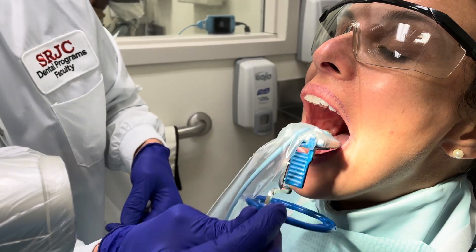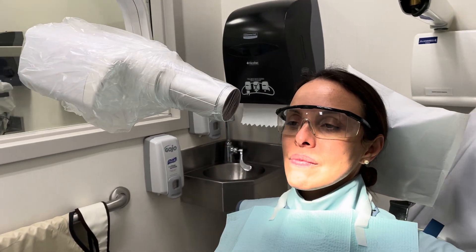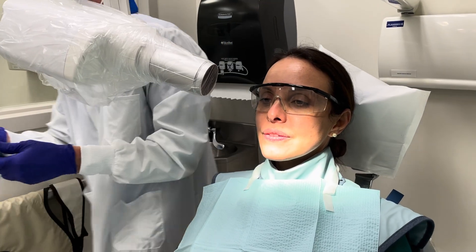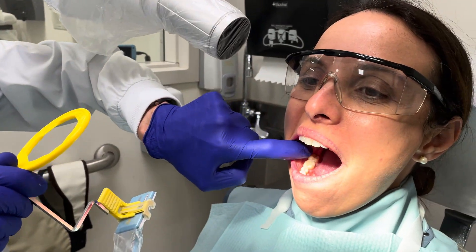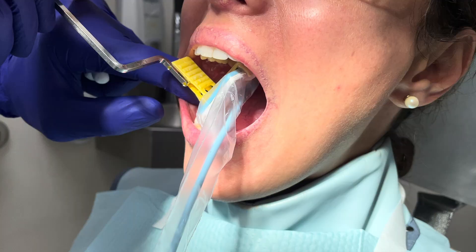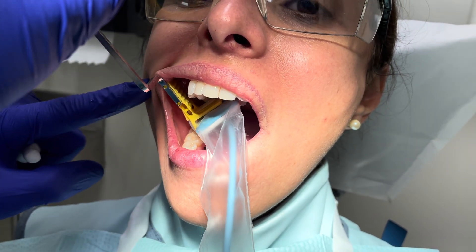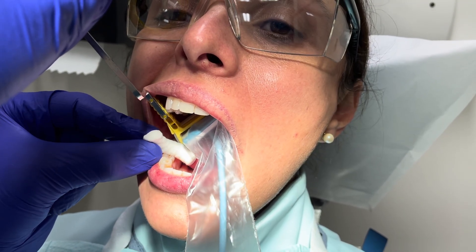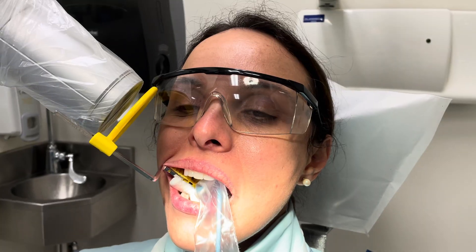Open please. Taking up gently, coming out this way. We're going to do maxillary right premolars — I do use cotton for this. I'm going to pull the cheek back with my non-dominant hand. Bring again the sensor in parallel to the occlusal plane. Once it's partway in, tilting. Bringing the bite block all the way in. Then pulling out against the commissure right here. At that point I can bring up. The bite block will now tilt up against the premolars, and so that it stays flat up against the premolars, I'm going to put a cotton right there. Slowly bite down, Maria.